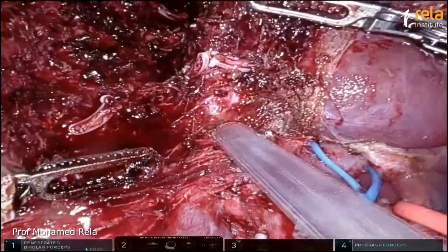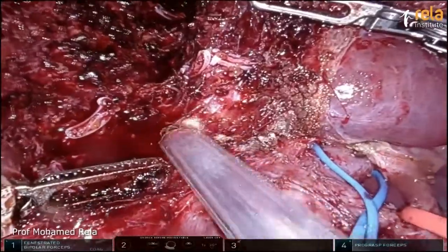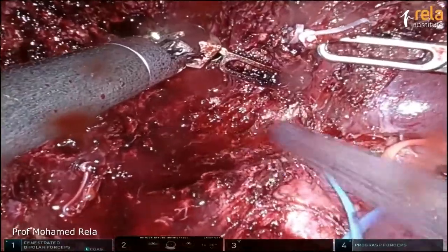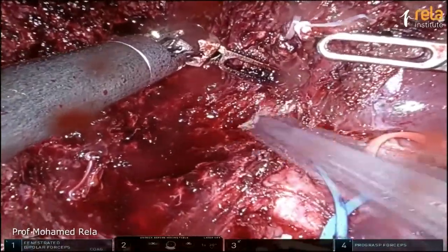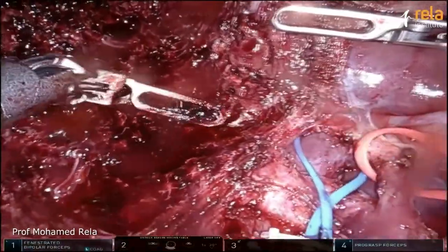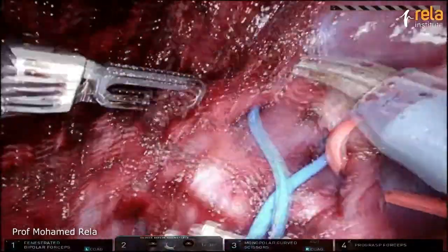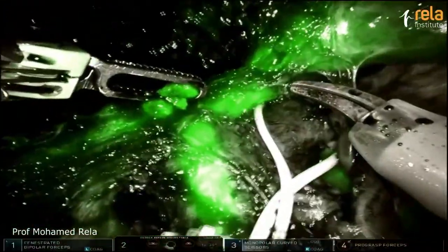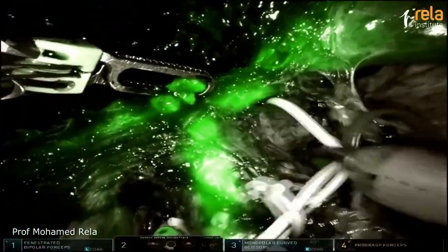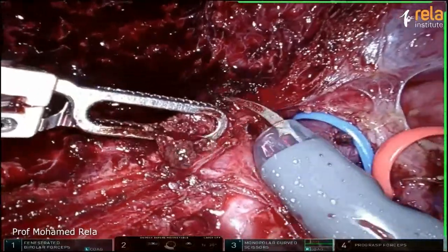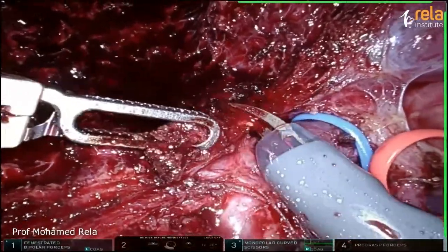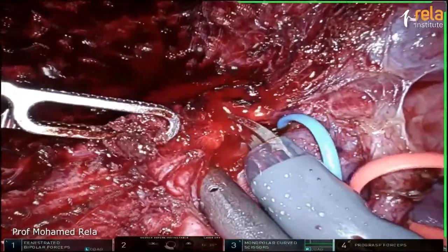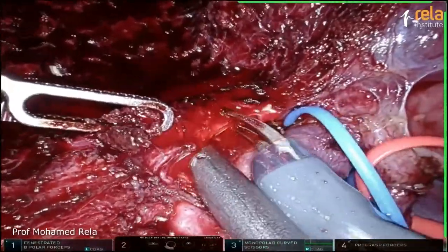For the left lobe and left lateral segment, we don't actually use a Pringle, whereas for a right lobe we sometimes use a Pringle — it's very convenient. That's the left duct. You can see ICG showing the left duct very clearly. We're going to divide it — just cut it and suture if there is any larger vessel. If it is away, we can also cauterize.